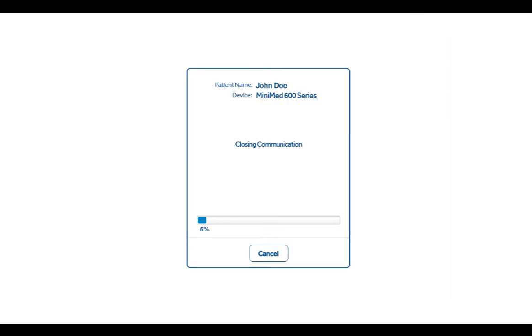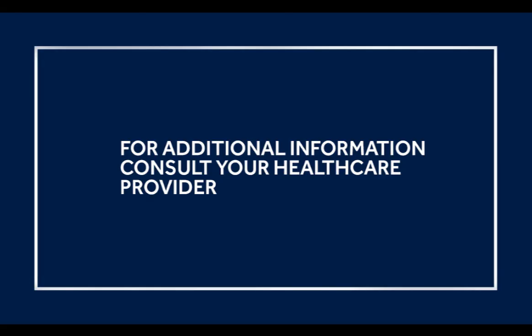With CareLink reports, you'll be able to learn more about your diabetes, which will allow you to take a more active role in managing your diabetes. If you haven't already, ask your physician if they'd like to link your CareLink personal account and automatically get your data without uploading in the office.